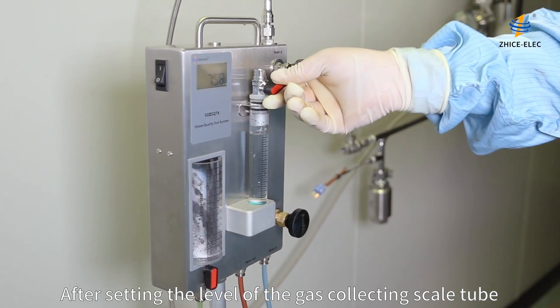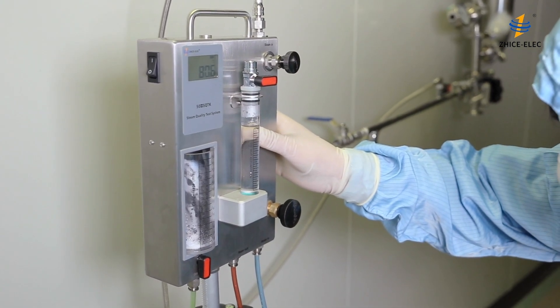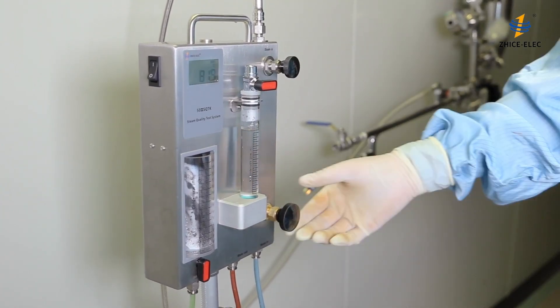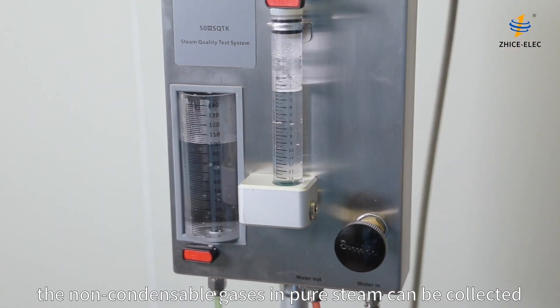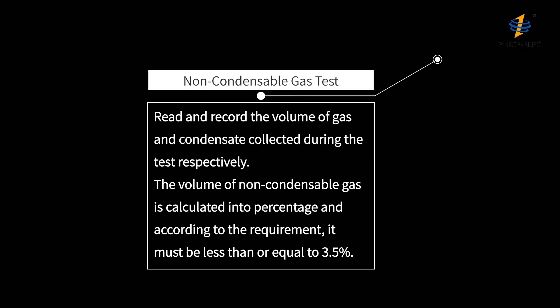After setting the level of the gas collecting scale tube and the condensate collecting scale tube to zero, the non-condensable gases in pure steam can be collected. When the condensate reaches the maximum level, shut off the pure steam intake valve. Read and record the volume of gas and condensate collected. The volume of non-condensable gas is calculated as a percentage and must be less than or equal to 3.5%.